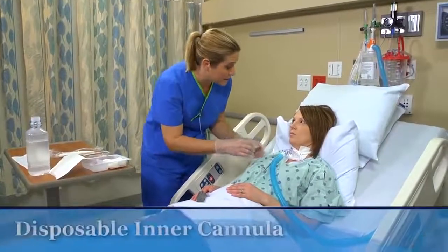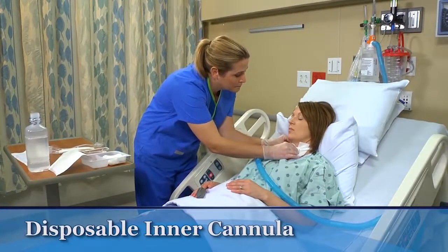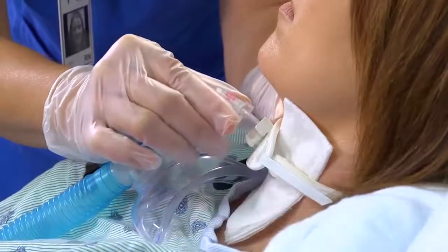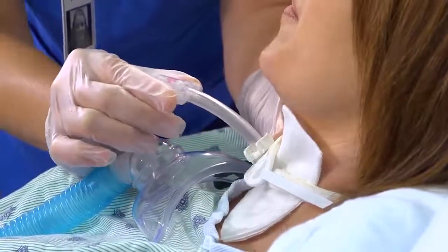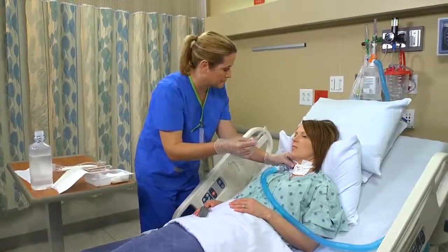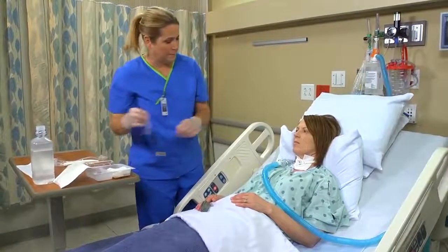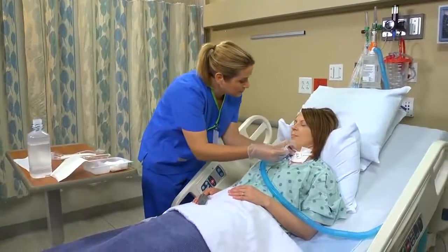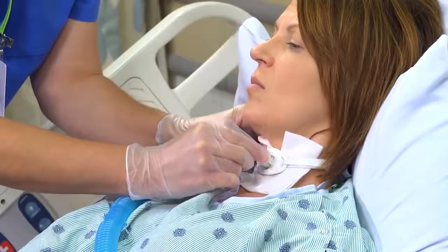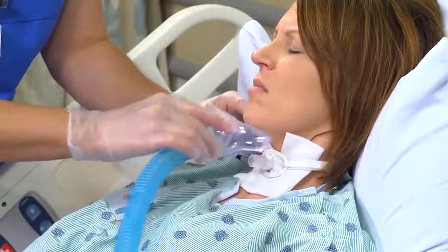To care for a patient whose tracheostomy has a disposable inner cannula, withdraw the used inner cannula, touching it only on the outside. Quickly inspect the cannula for secretions and dispose of it. Then place the new inner cannula and lock it into position. If necessary, reconnect the patient to the ventilator or other oxygen source.